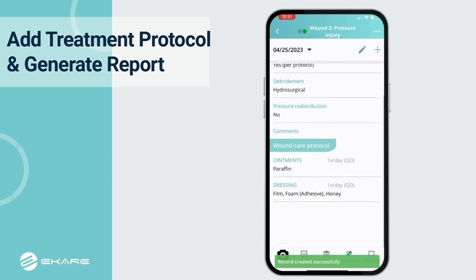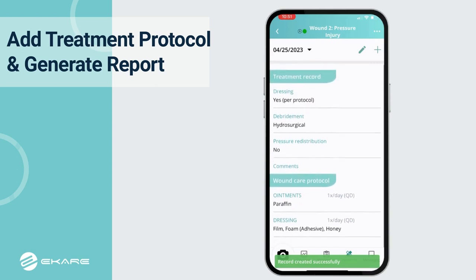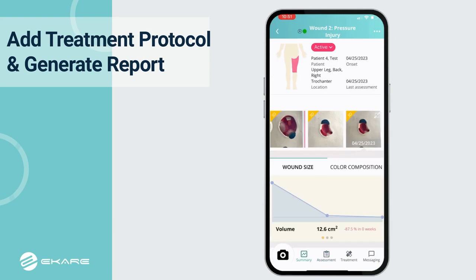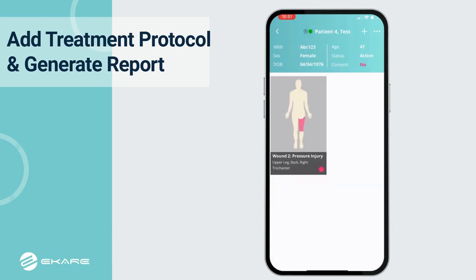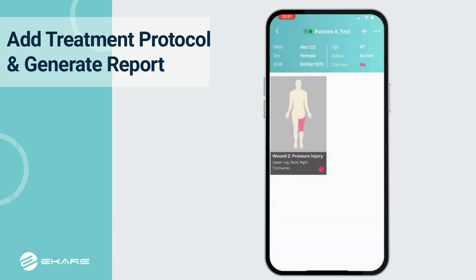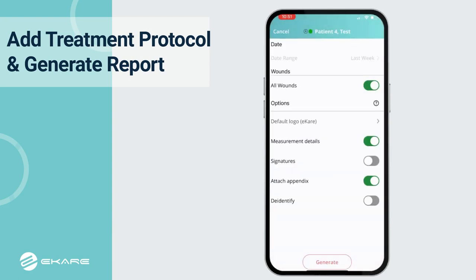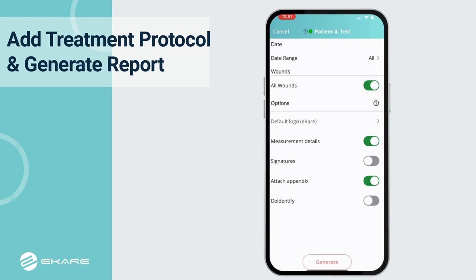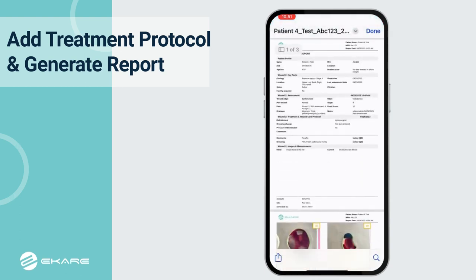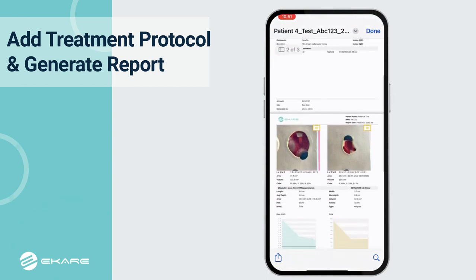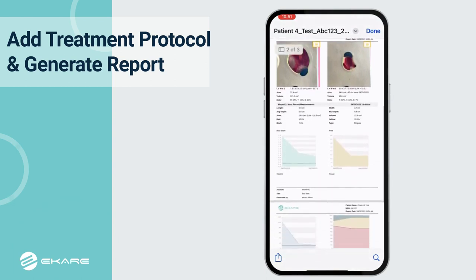Once the treatment record and wound care protocols have been saved, users can review the information and easily generate a custom assessment report. Users can select a preferred date range for the data summary. The report can be easily downloaded in PDF format and shared with the care team as needed.